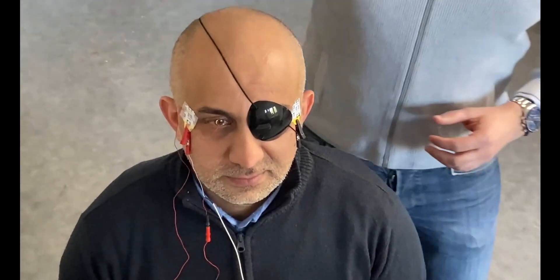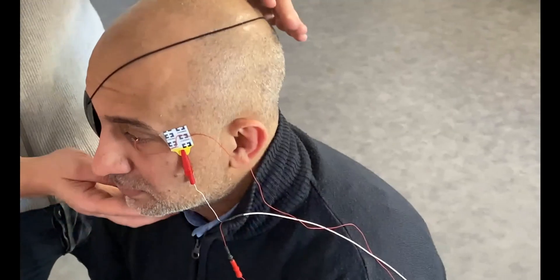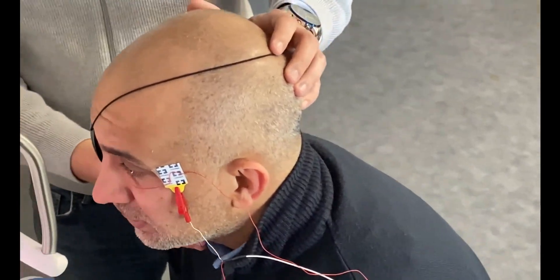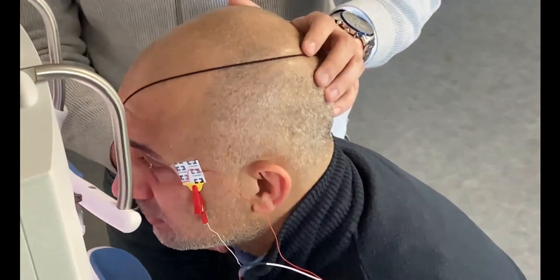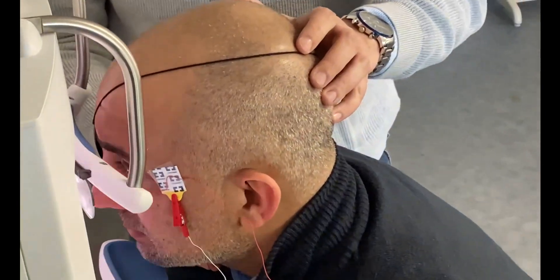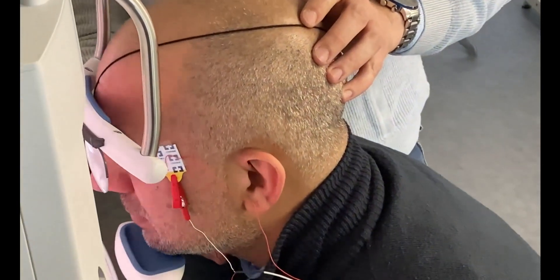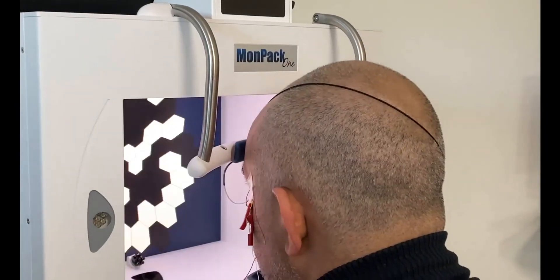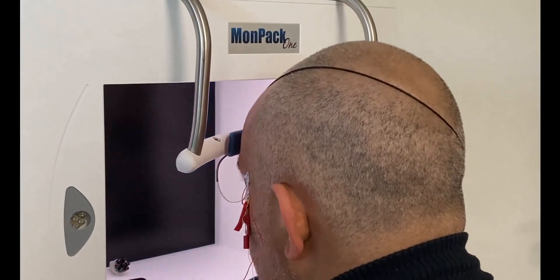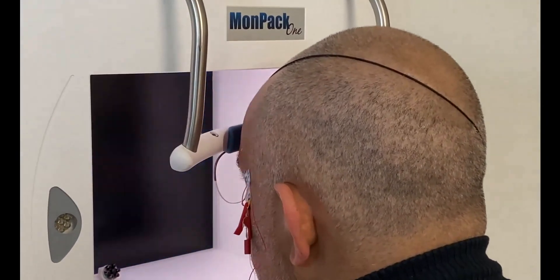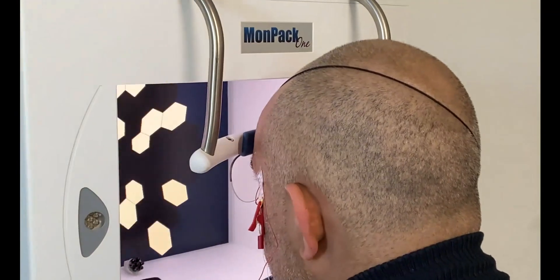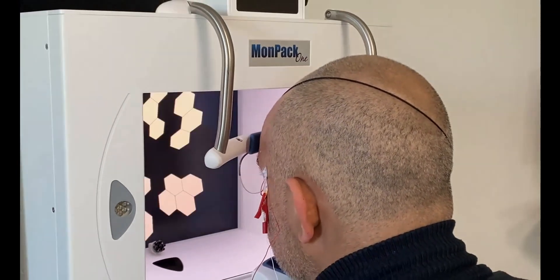Our happy subject is now ready for the exam. We will move to the headrest and install him as comfortably as possible to avoid any muscular contraction that may create artifacts in the recording.